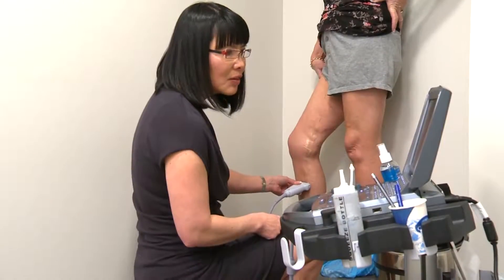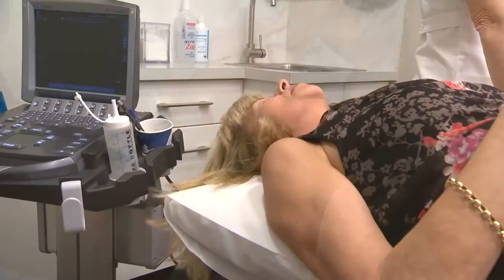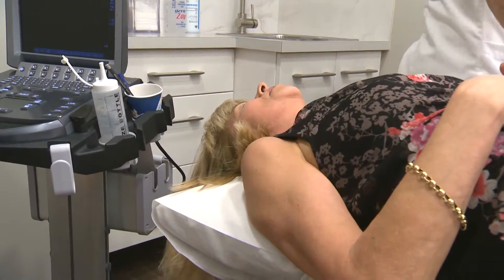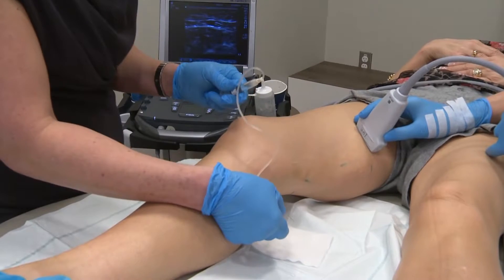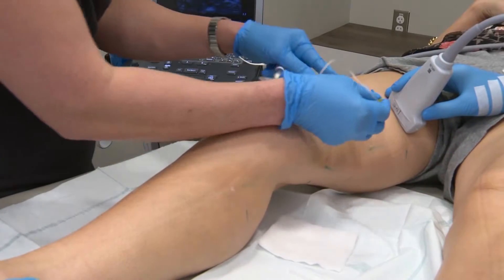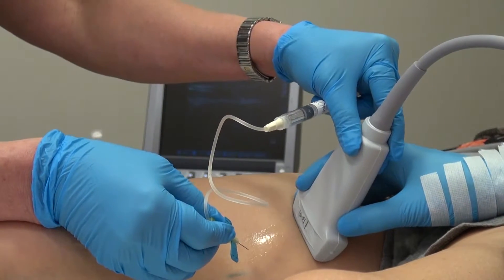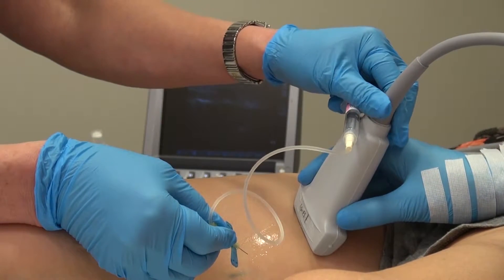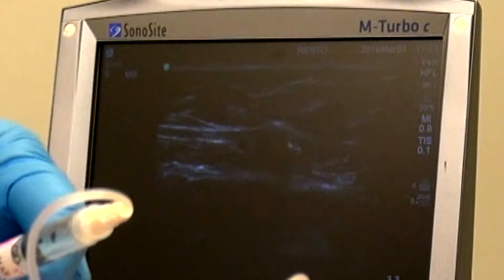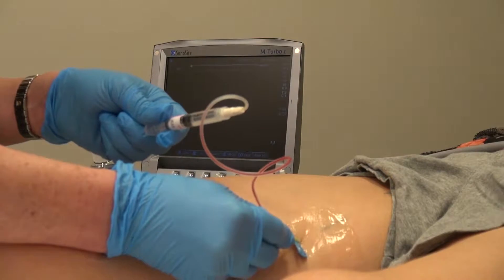With the help of the ultrasound, we mark the areas to be injected. The vein is too far below the skin to see with the naked eye. We start treatment at the highest point of the leg that we have marked out. We then obtain access to the vein using a needle under ultrasound guidance. We can see the needle inside the vein. We also aspirate to ensure that we are within the vein.